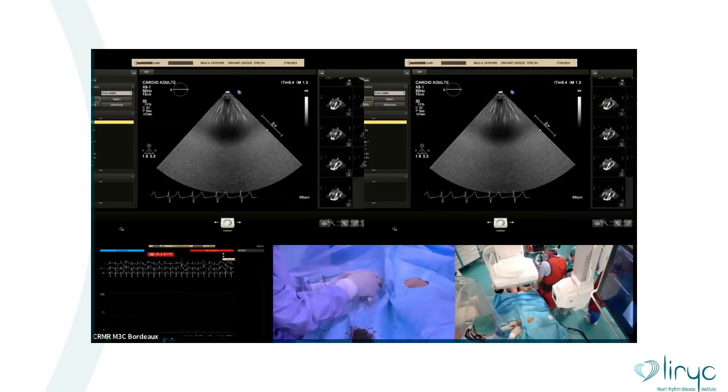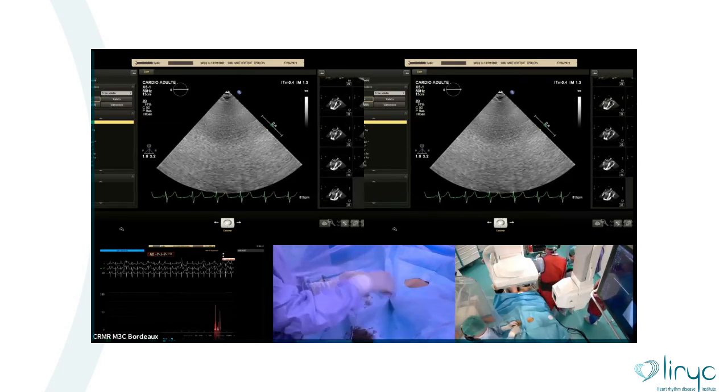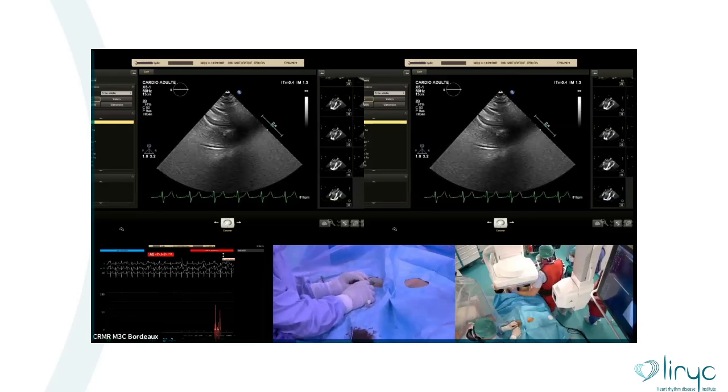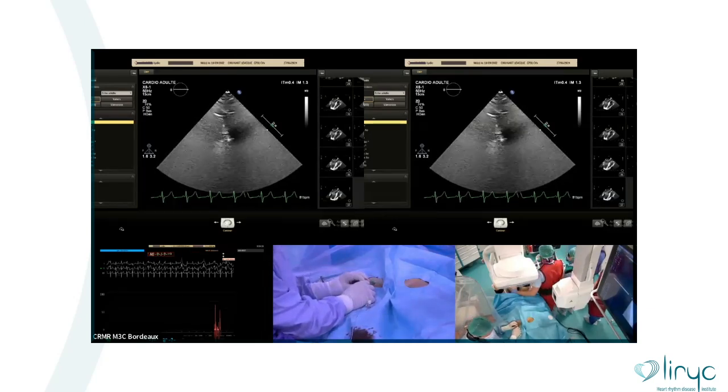It's similar to fluoroscopy. Even if we use fluoroscopy, we also should advance the wire past.